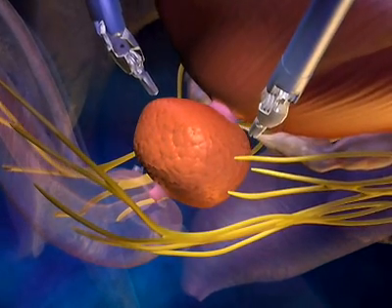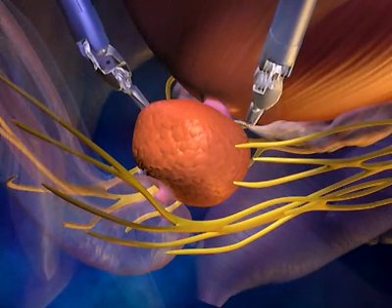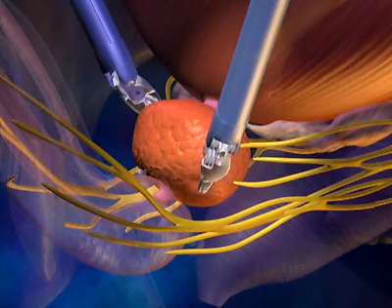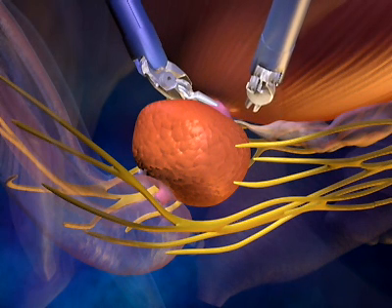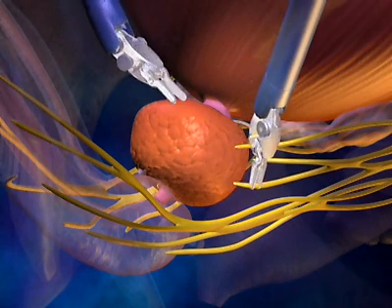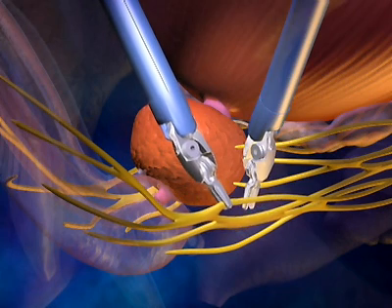During the removal of the cancerous prostate, your surgeon works to spare these very delicate structures utilizing the articulating da Vinci instruments and a highly magnified 3D view of the anatomy provided by the system. This added control and precision may assist the surgeon in preserving the anatomy necessary for urinary continence, as well as the nerve bundles responsible for erections.